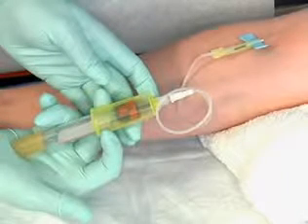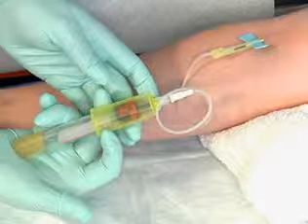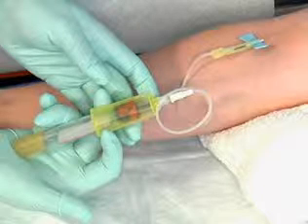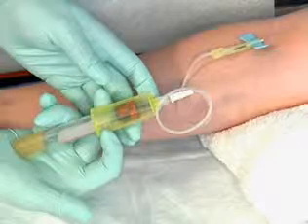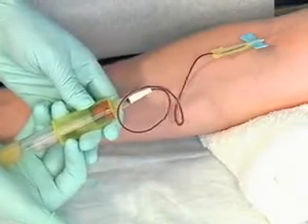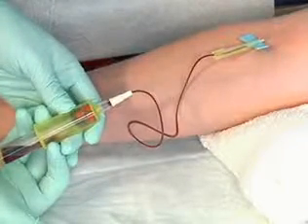Pick up the holder and tube, keeping them in a downward position. This allows the tube to fill from the bottom up and not near the rubber stopper, which prevents venous reflux. Position the label so that it faces down so you can observe the blood as it fills the tube. Slowly push the tube forward to the end of the holder. This causes the posterior needle to puncture the rubber stopper.